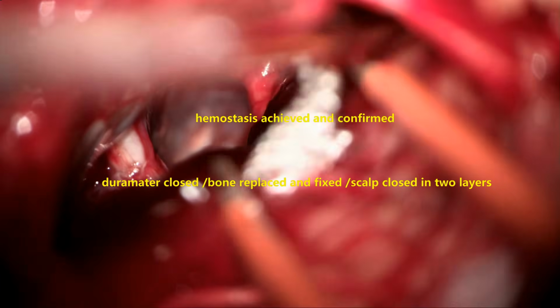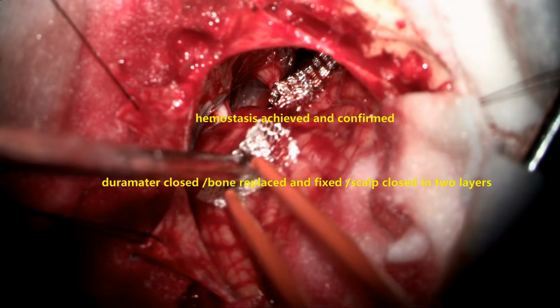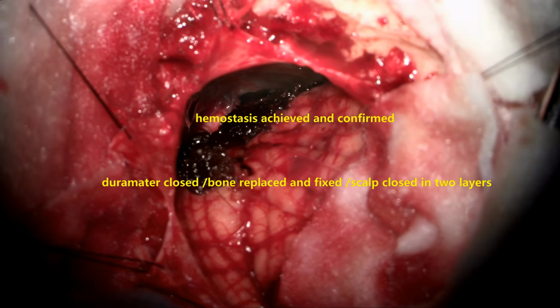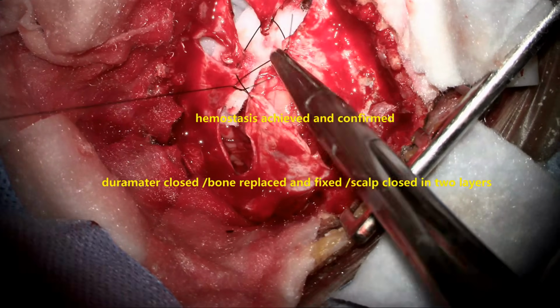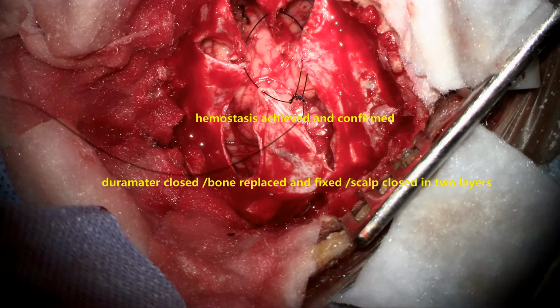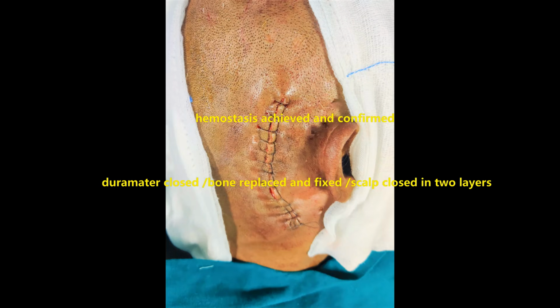This is the complete excision of the lesion anteriorly and decompressing or removing the tumor all around the trigeminal nerve, which he came for with the severe trigeminal pain. Now he will be completely relieved of that. Absolute hemostasis is achieved and confirmed. Dura mater is closed with the fascia muscle graft as much watertight as possible and scalp closed in 2 layers.